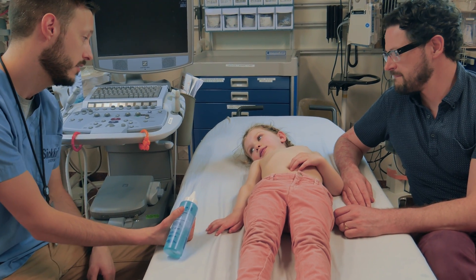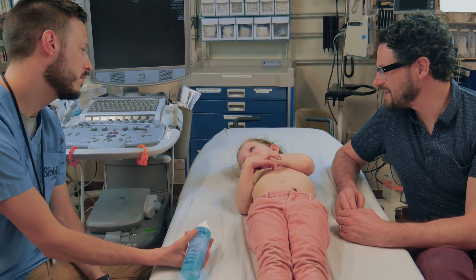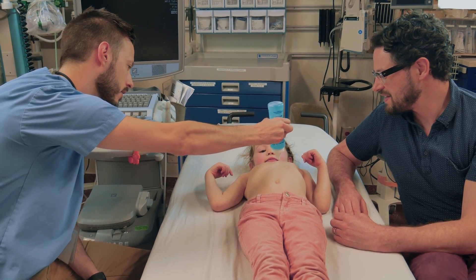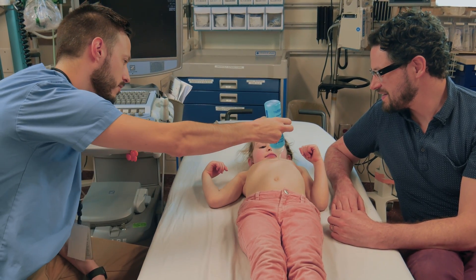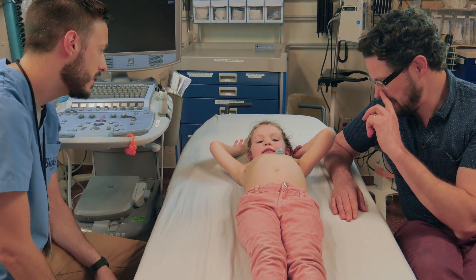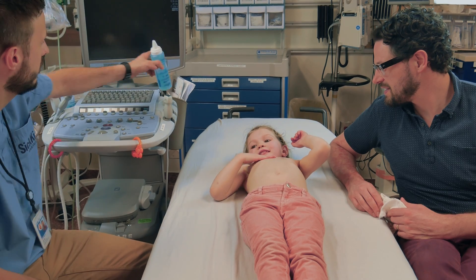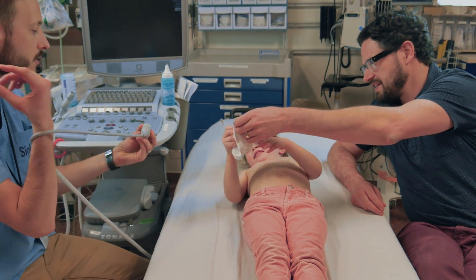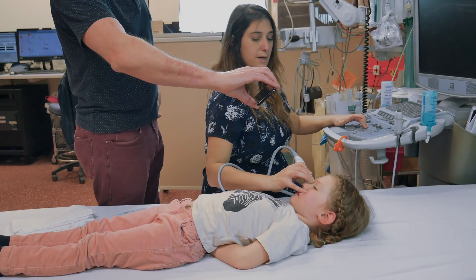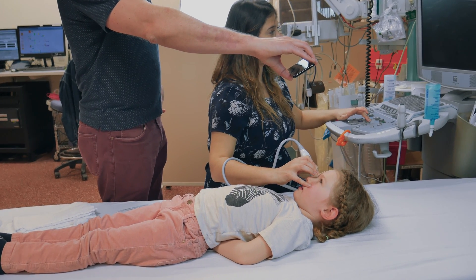In terms of the child's position, they may be on the bed themselves or in the parent's lap. If a child is not sitting on a parent, have the parent beside the child to give them comfort. Before scanning the child, introduce them to the machine and the probes. Methods include showing the child the probe and jelly, allowing the child to touch the probe and jelly, putting a dry probe on yourself, the parent, or the child's body in another location than the eye, allowing the child to put jelly on themselves, and showing them the tegaderm and demonstrating on yourself how you will put it on. You may also give the child some autonomy by asking which eye they would prefer to start with.